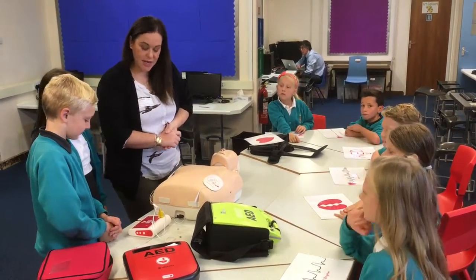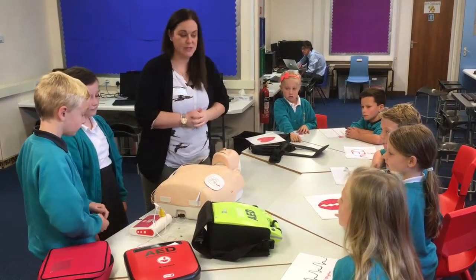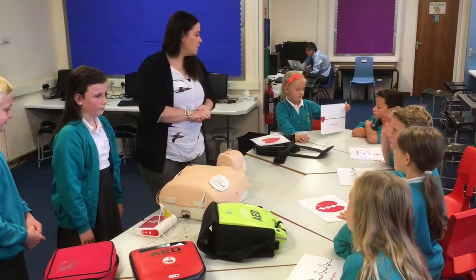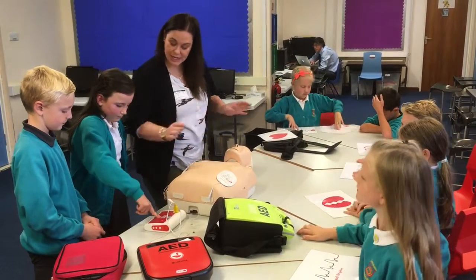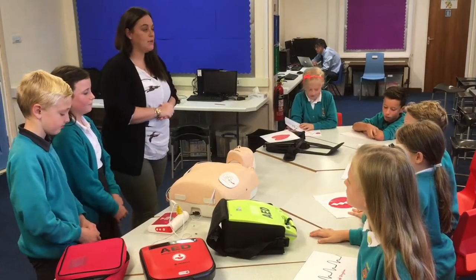Shock advised. The machine is telling us that we have a bad rhythm. Charging. So it's now going to deliver a shock, which will make it into what rhythm? What are we looking for? Deliver shock now. To make it a good rhythm. So you push the button - stand clear. Shock delivered.